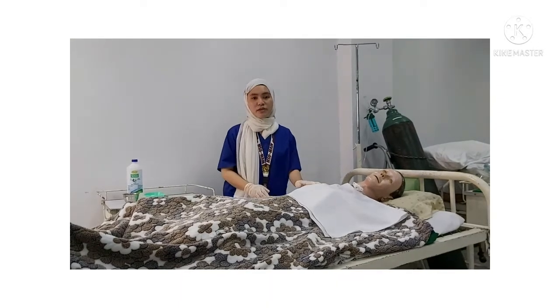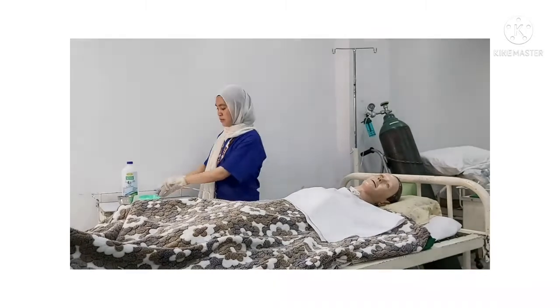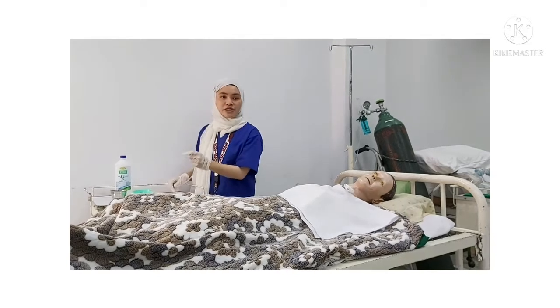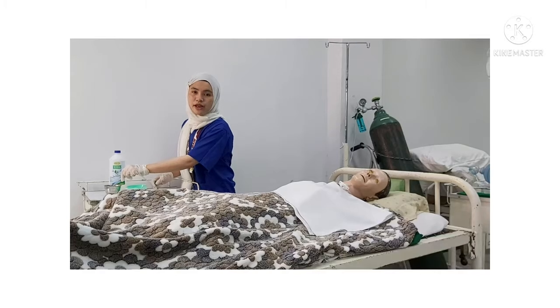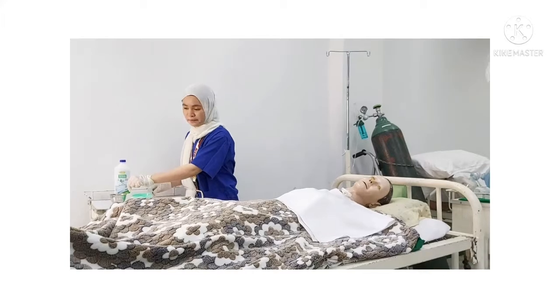Hyperventilate the patient to help prevent suction hypoxemia. Flush the catheter with a saline solution or sterile water, and this is done to achieve a clean passage of air.